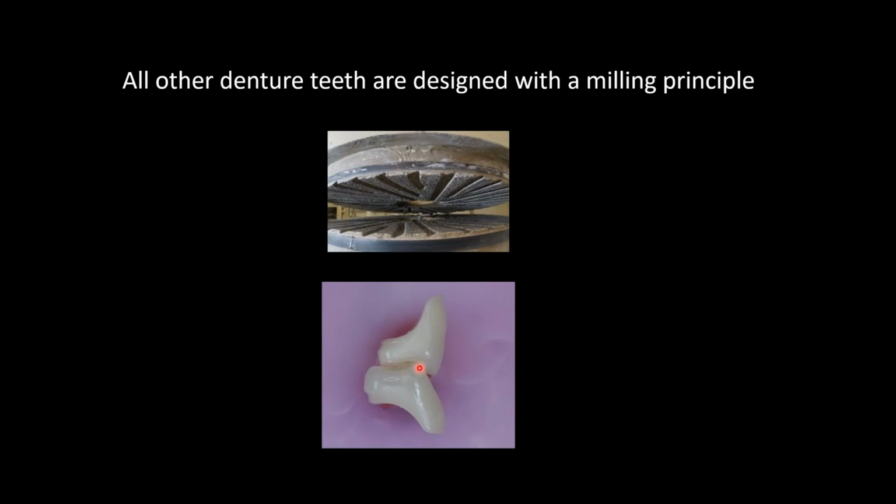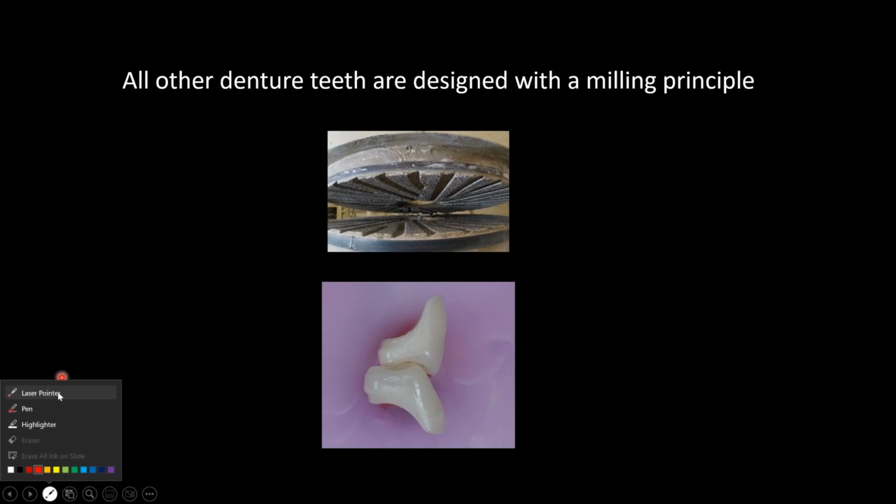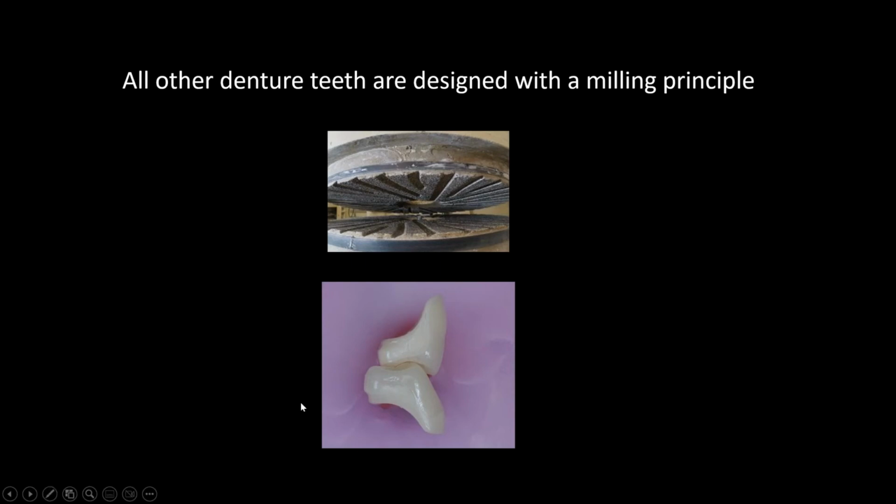So look at the difference on our good old 20-degree teeth that I was also taught on. These are like milling, like a flour mill. And the design is very similar. And a mill works by grinding, and it has to be horizontal, whereas a mortar and pestle is up and down. This has trouble crushing the lettuce. This has trouble, period, because again, the motion of this has to be horizontal, which rocks the denture base, which causes the ill fit. And you wonder why the denture adhesive market in the US is a $150 million a year market.